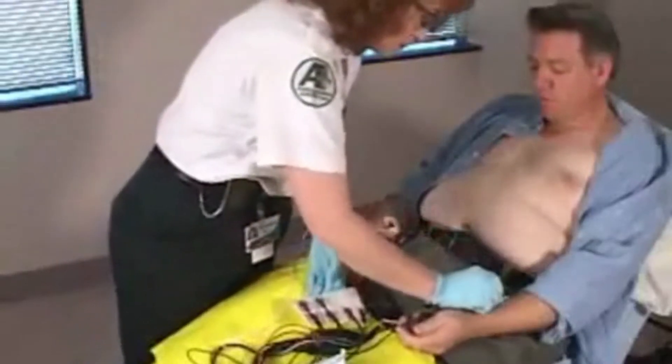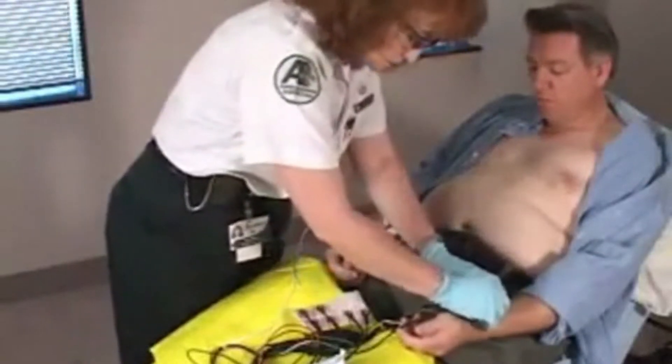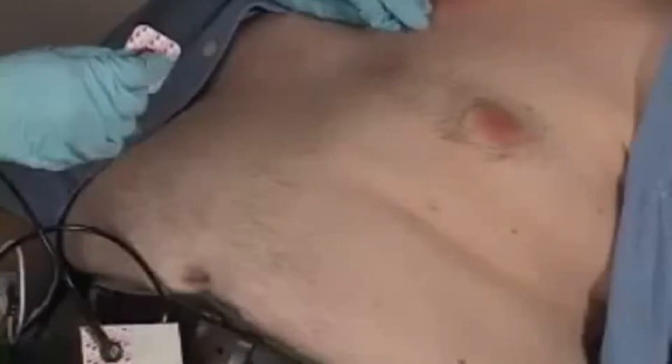Proper lead placement is essential when obtaining a 12-lead ECG. It is preferable to place the limb leads on the extremities.